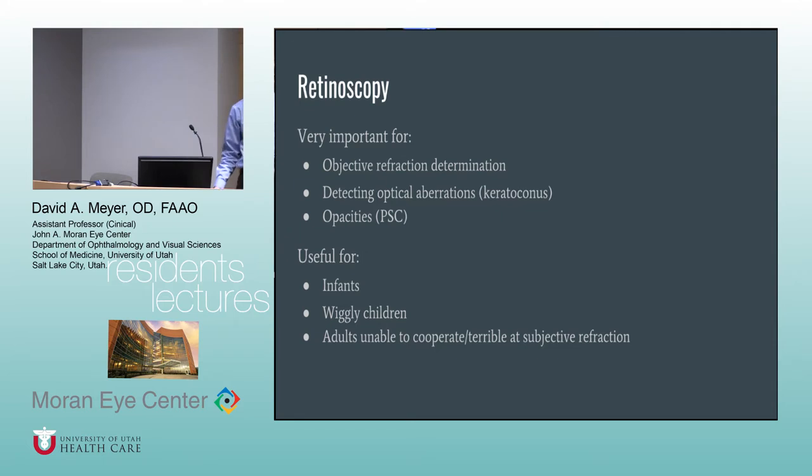Sorry. Anyway, obviously it's really good for infants. We see a lot of infants over at the optometry section. We see a lot of aphakic infants. Obviously that's crucial for that. Or just kids that are wiggly. Or we had a patient this week who has a self-induced traumatic cataract. He also has Down syndrome. It was really sad, really heartbreaking, but he's doing some self-induced trauma. With a patient like that, there's no way you're going to be able to go through subjective refraction and ask him what's better, one or two. You have to rely on your retinoscopy and get as close as you can.